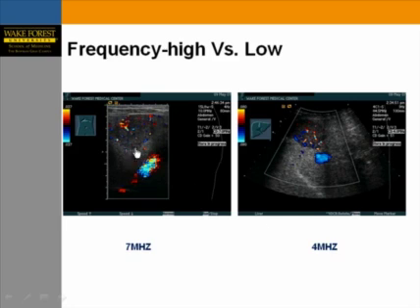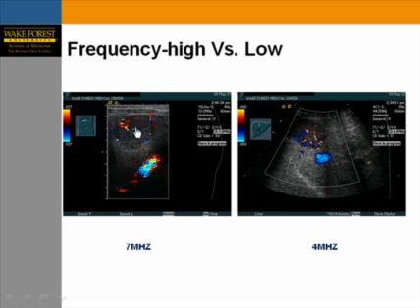Here are two examples. At 7 MHz, scanning a liver mass shows vascularity mainly in the superficial component. Using a lower frequency 4 MHz probe on the same patient and plane, more color Doppler is visible in the center and deepest components of the mass.